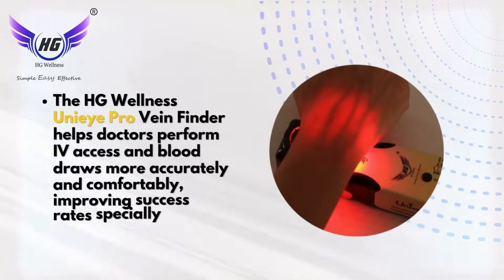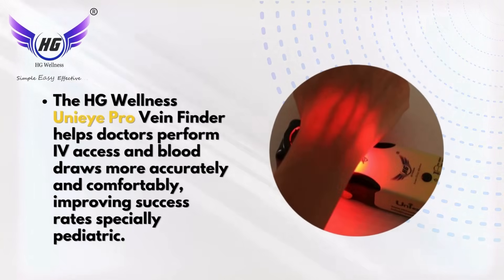HG VF Uni-Eye Pro. The HG Wellness Uni-Eye Pro Vein Finder helps doctors perform IV access and blood draws more accurately and comfortably, improving success rates especially in pediatric patients.